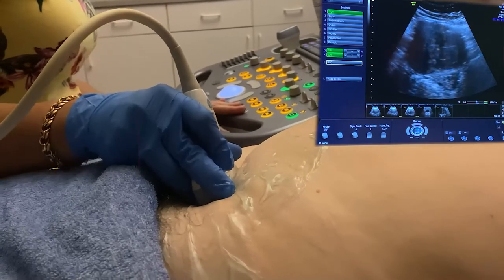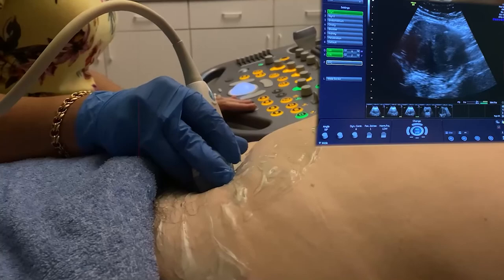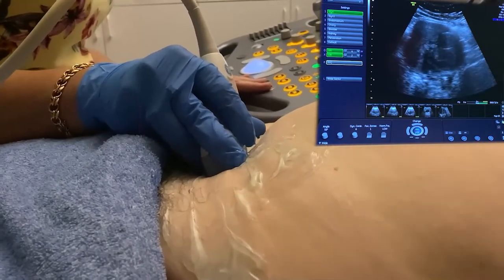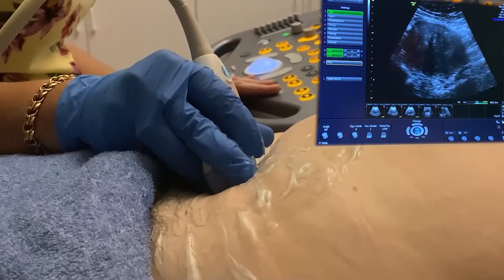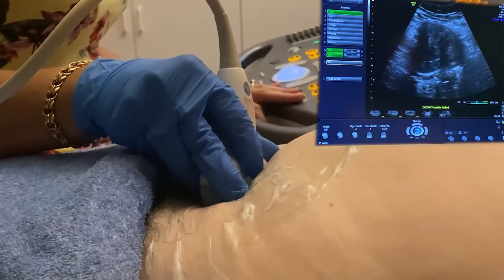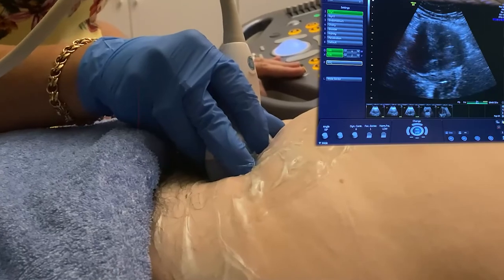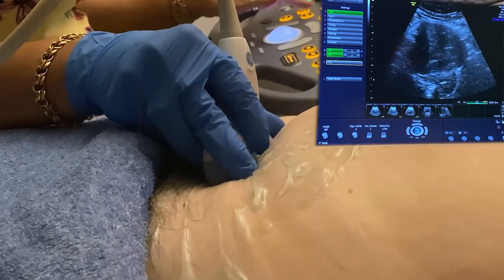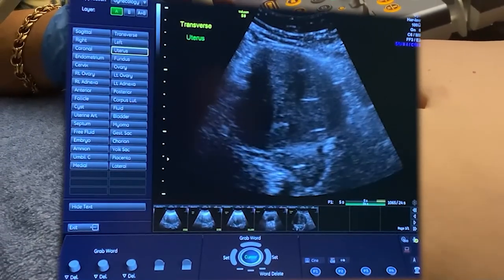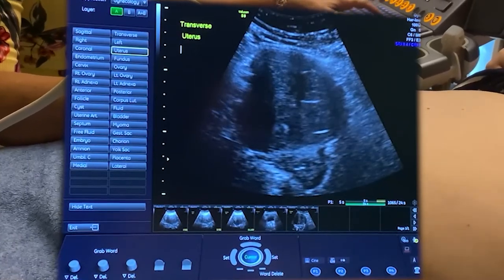Remember, in ultrasound, as a sonographer, we are trying to tell a story by giving representative pages to the book so that by the end of the images, they'll have the whole picture or the whole story. The person that is interpreting your images generally doesn't have real-time images to help them, and so we have to provide a full and concise story.